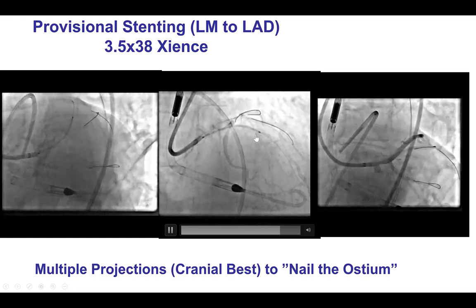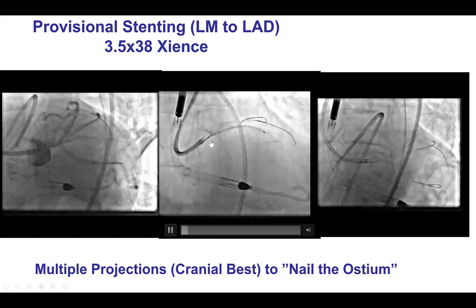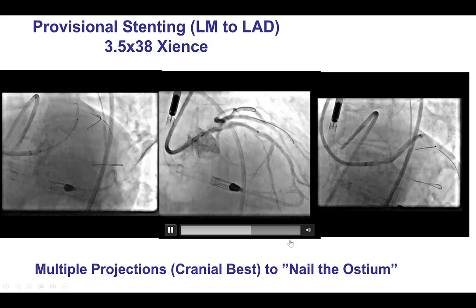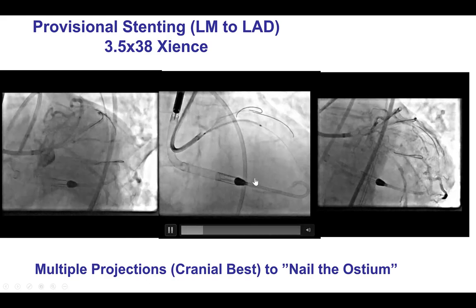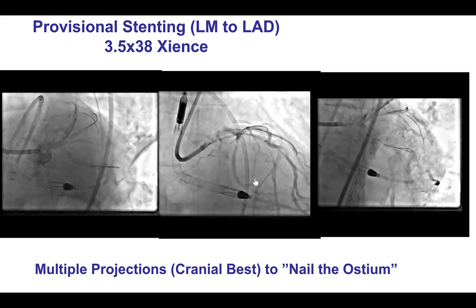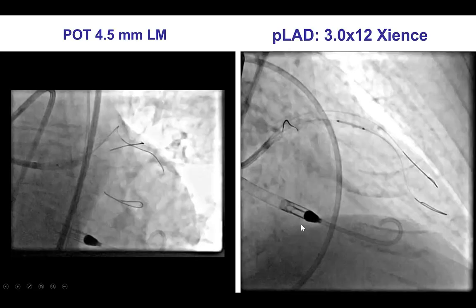We stented into the LAD, which seemed to be the bigger vessel, and used multiple projections to ensure that the stent was covering the ostium of the left main. This is something critical for all ostial lesions. If the ostium is uncovered, that can lead to restenosis. If there is too much stent prolapse, that can be a problem as well. You don't want to miss the ostium, and at the same time you don't want excessive overhang of the stent into the aorta. Make sure before you place the stent that the lesion is well prepared and that the stent is going to expand.